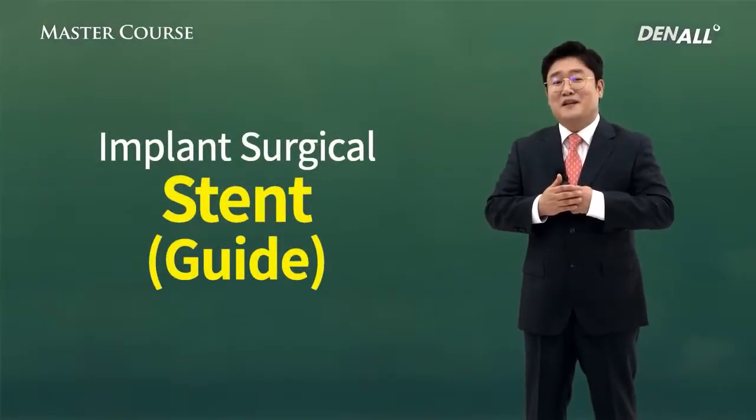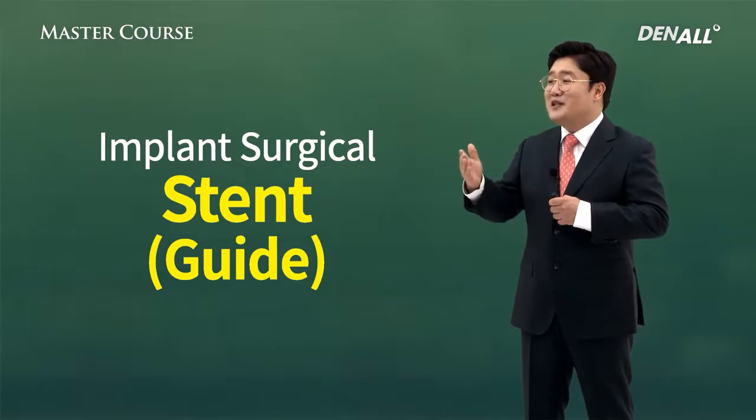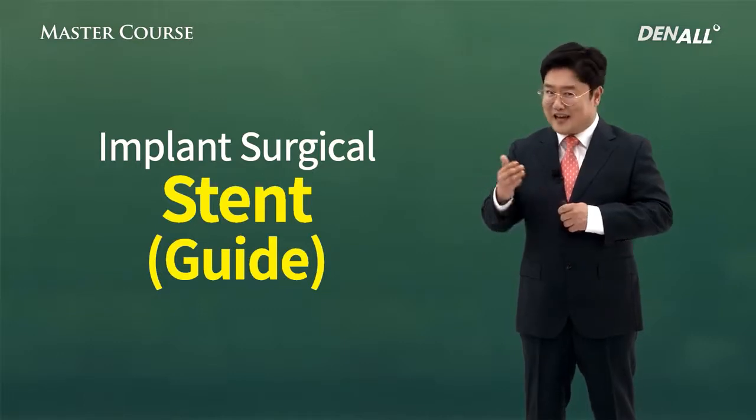Another thing, in the past, panorama was very actively used because it was used for the implant surgical stent. The stent is sometimes called a guide.